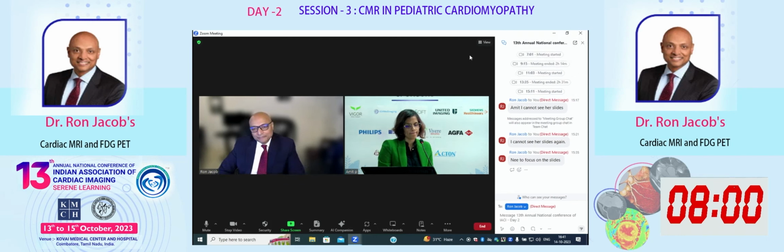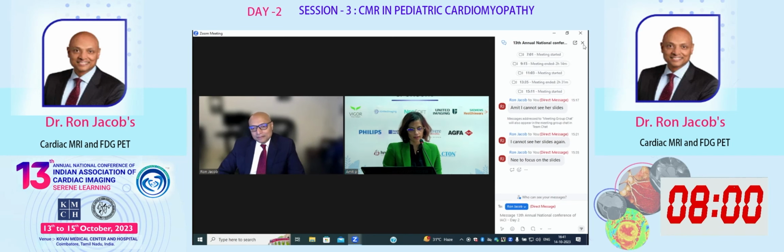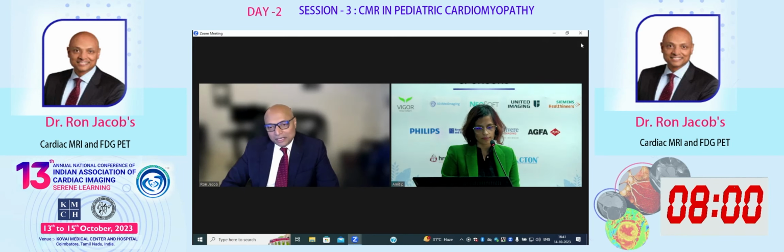Yeah. Let me take the first question first. The CMR negative but PET positive sarcoids. Was that the first question? Yeah. So I would look at that very carefully and see why that is. For example, if your parametric maps are completely normal, your STIRs are normal, there's no LGE and normal LV function, I would make sure, first of all, that you're adequately suppressed.